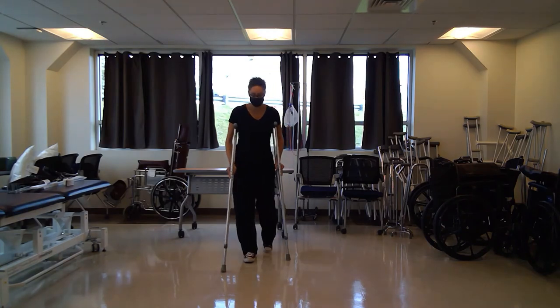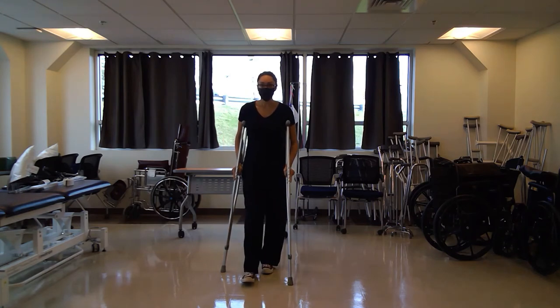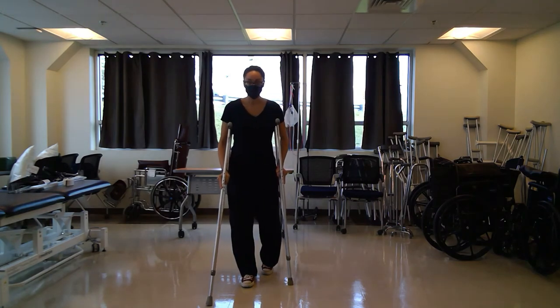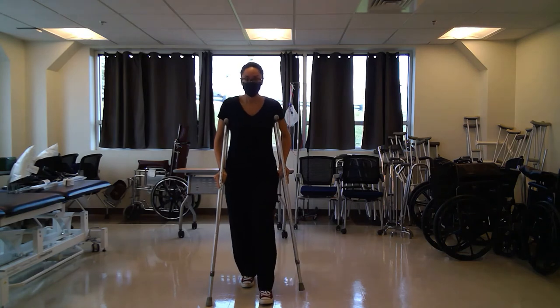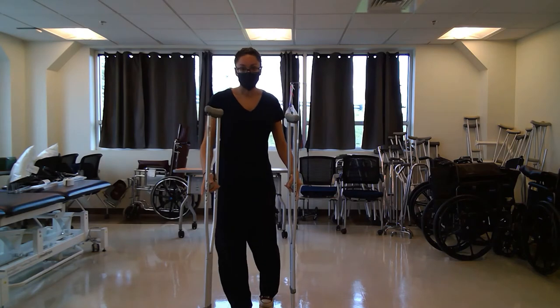Right crutch, left foot, left crutch, right foot. And you keep going with that pattern.